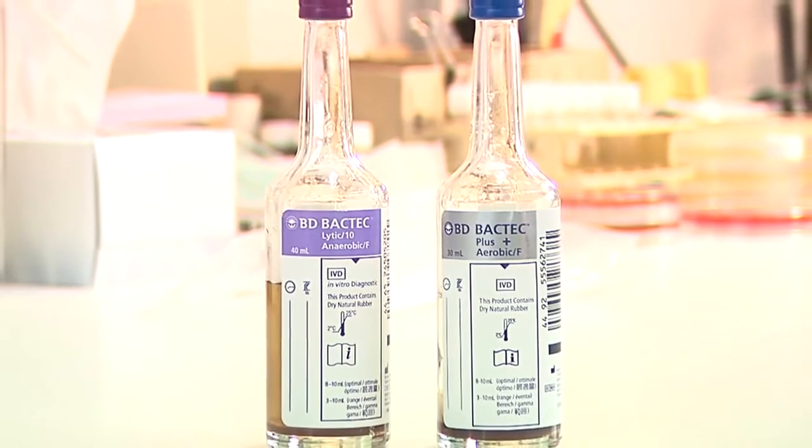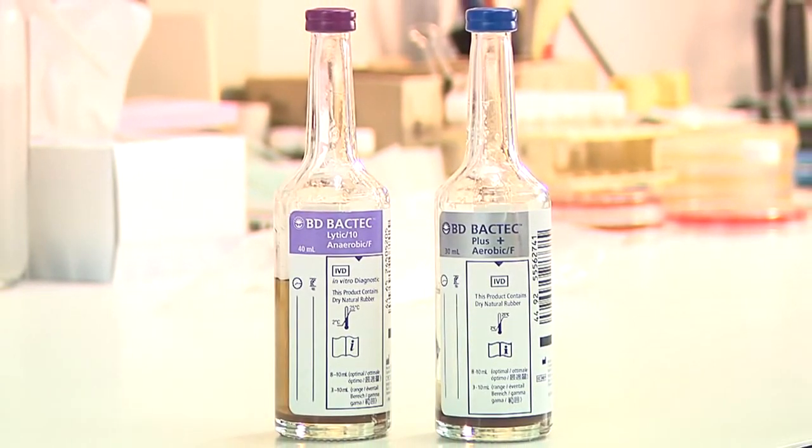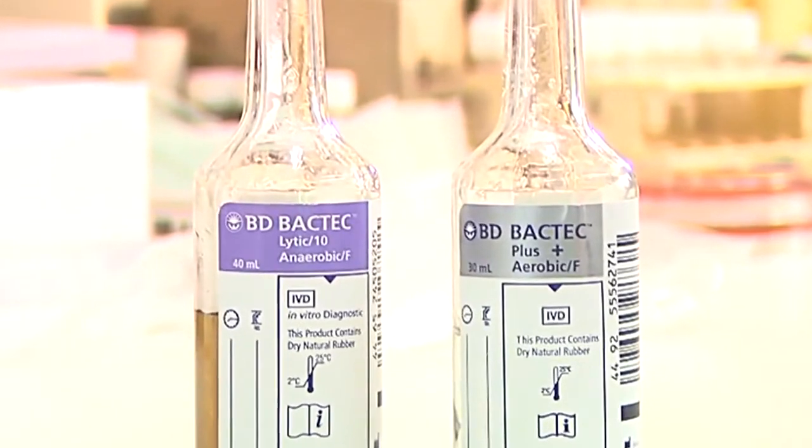These particular bottles are Becton Dickinson Bactec FX bottles. Several media types are available, but the most common ones used are aerobic and anaerobic media bottles. The media contains nutrients and growth factors to support the growth of the organisms. They also contain resin beads to help to neutralize the effects of antibiotics and neutrophils and other potential inhibitors that may be in the blood.